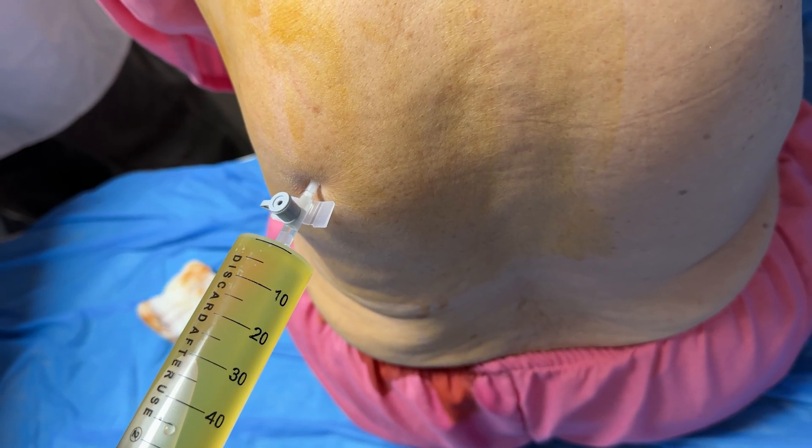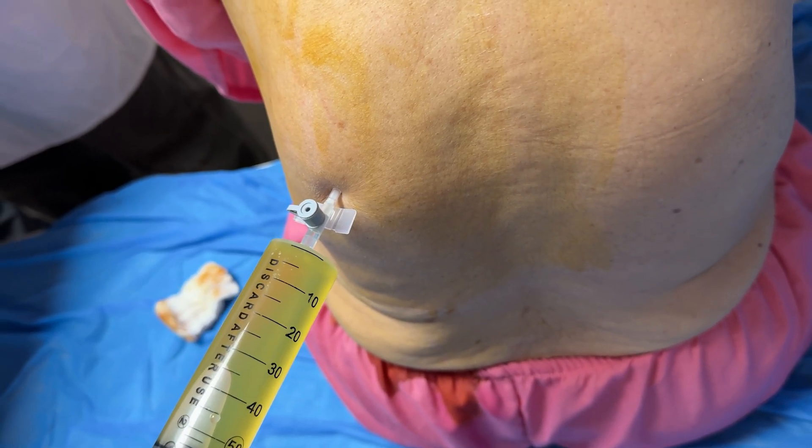We'll send samples for cell count, protein, LDH, cytology, and cultures.